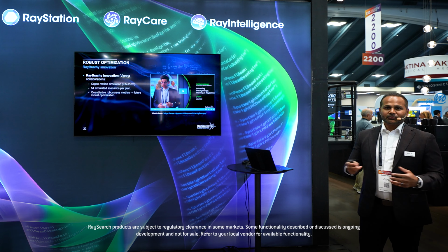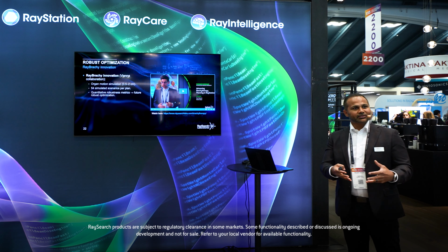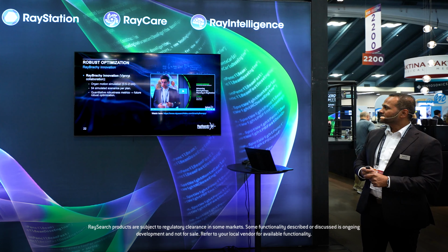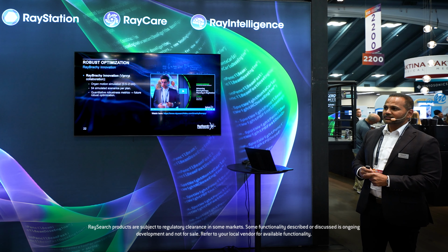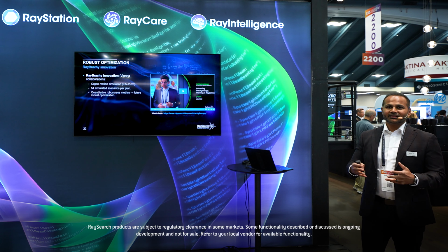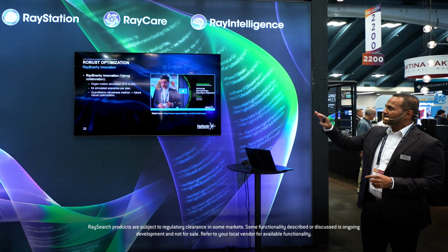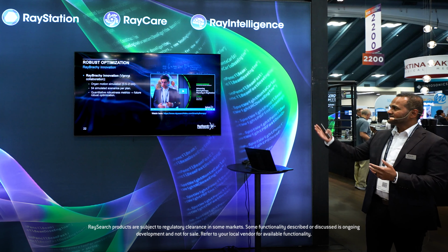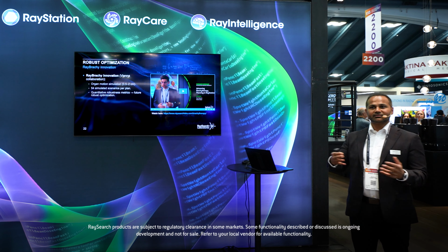Robust optimization. That's one thing that RayStation sort of innovated with protons, and it's in photons as well. But you can apply it to Brachy. So we have a great talk on that. That was an innovation with Vienna, doing a collaboration with them. They made use of some of the functionality that's existed in RayStation for a very long time, right? Organ motion simulation, creating 54 simulated scenarios for plans. And what that does is the quantitative robustness so that you can make your robust application.